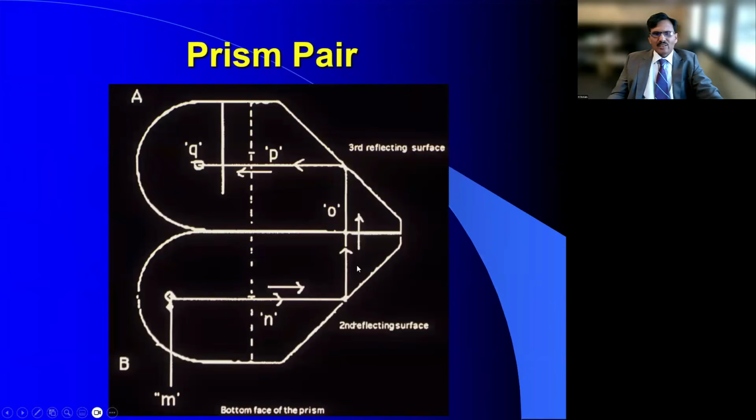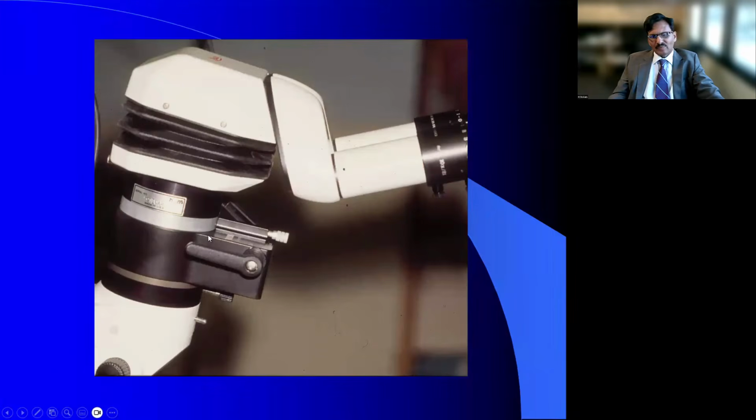So there are two things that you can do. There are inversion prisms. This is a prism pair that is incorporated with an attachment to your microscope that can invert your view. As you can see in this particular animation, this is the inverter added. So with this clip you can either invert or re-invert depending on what you're actually doing in the case.